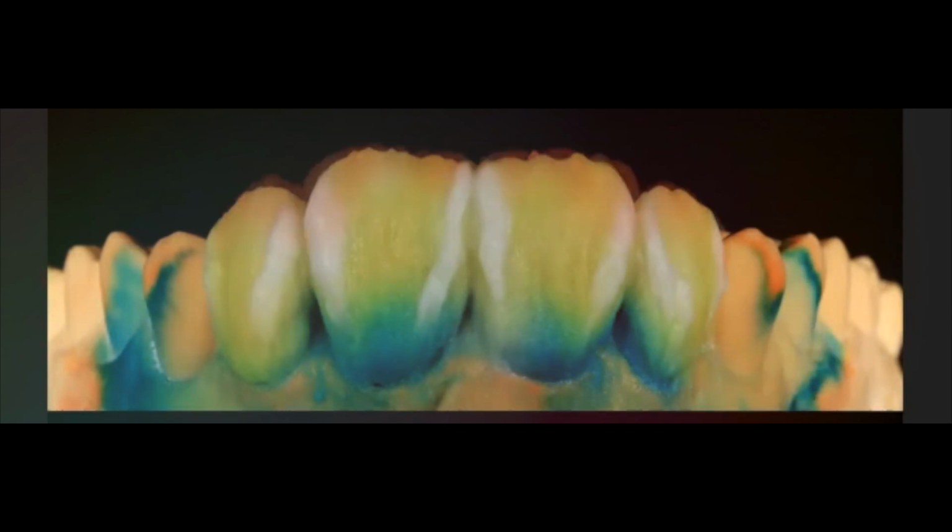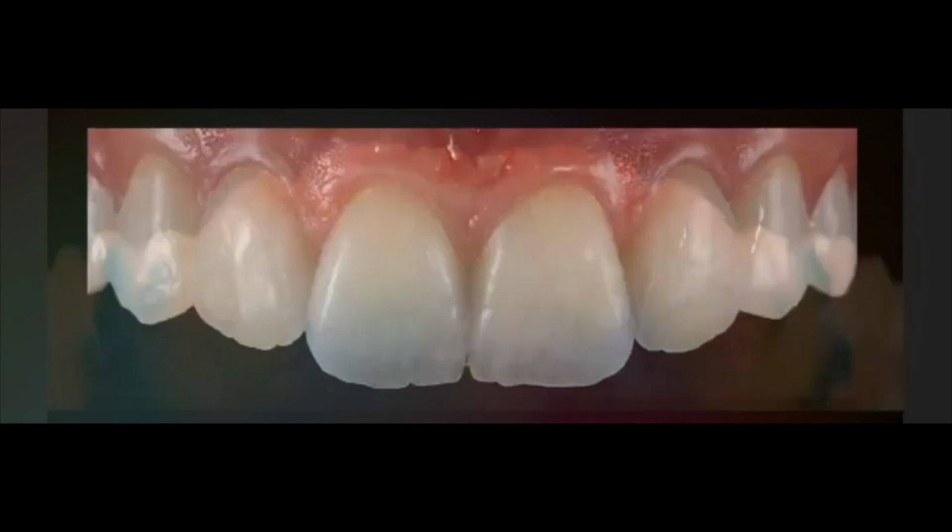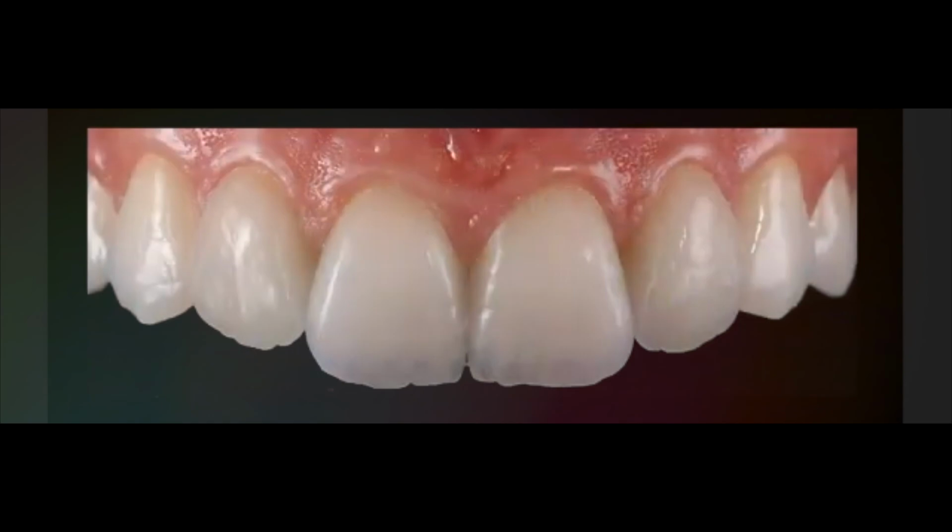ELT2, halo effect, white powder, and this is the result with just 1 firing.